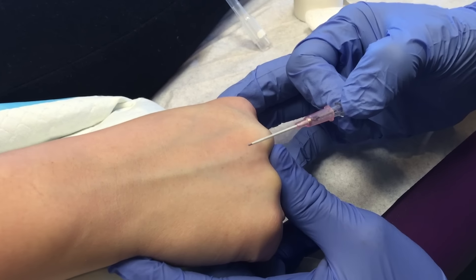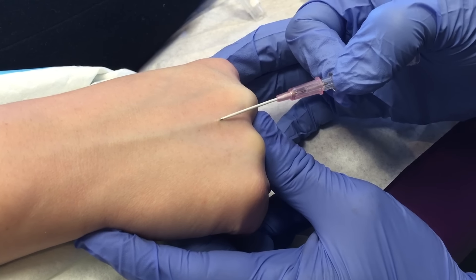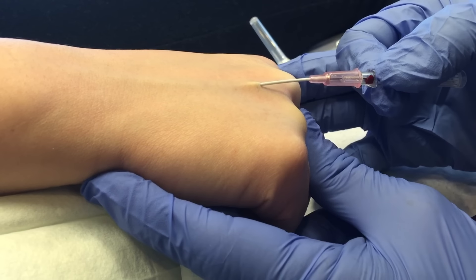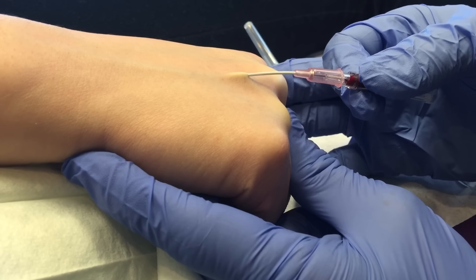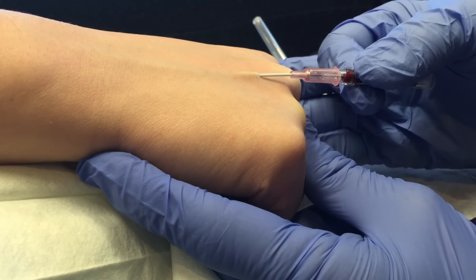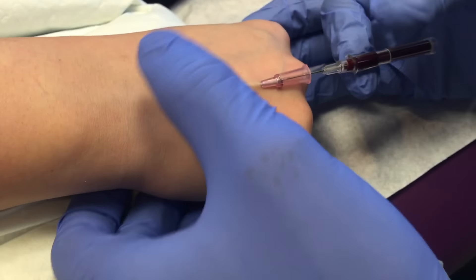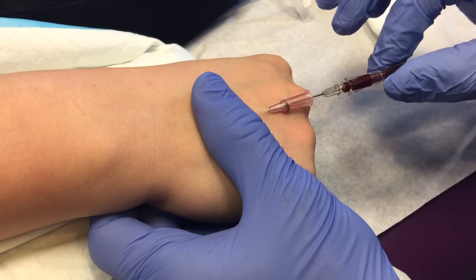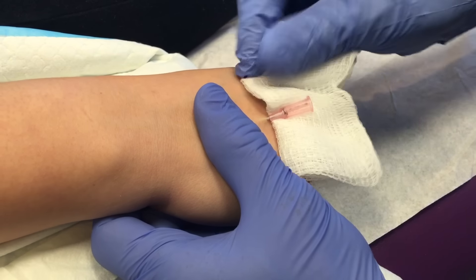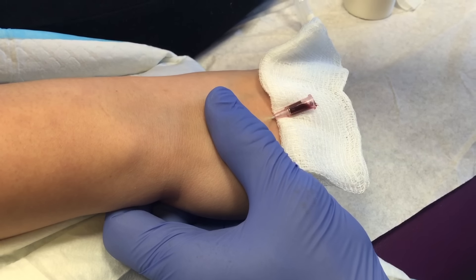I anchor the vein down. Now the most important part — I kind of raise it up a little. I'm not in the vein yet. Now I got the flash. Now I can lift up quite a bit — see, I'm still going in and I can keep going in. Now I'm about a good half centimeter in and I can slide this in. That catheter is well in because I'm going to let it go — see? So we know we're well in.